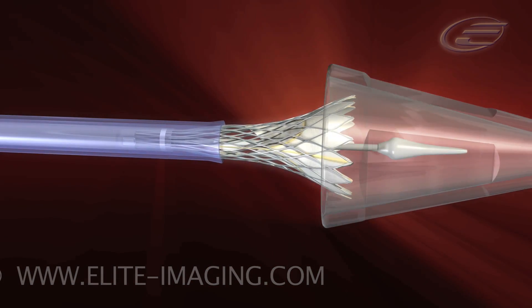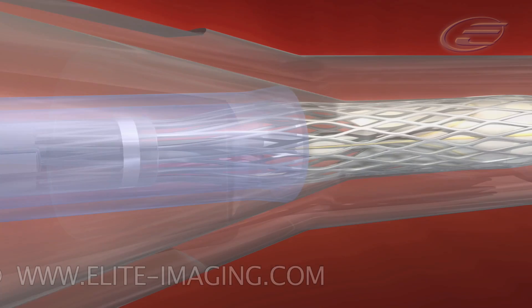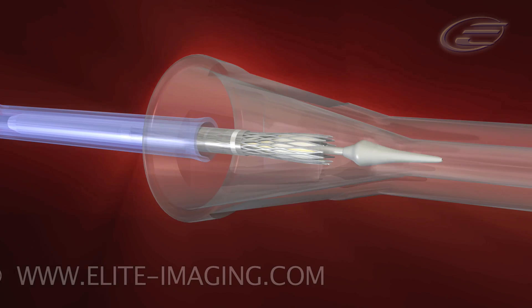Slide and advance the inflow cone over the inflow end of the frame until it touches the outflow tube. Slowly continue loading the valve by using the micro-knob on the handpiece. Remove the inflow cone.